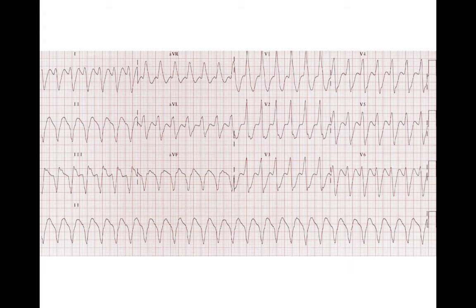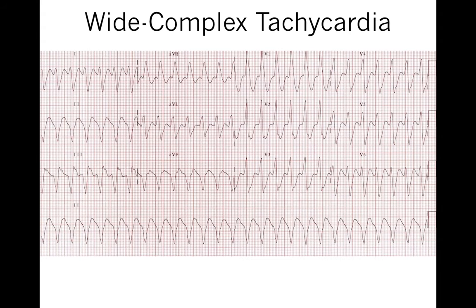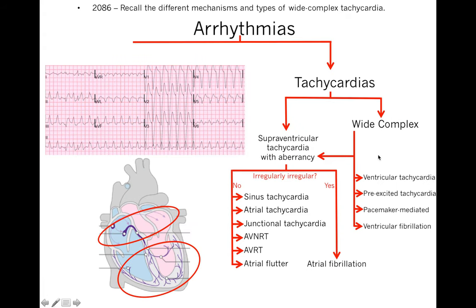Please interpret this ECG. This is an example of a wide complex tachycardia — the heart rate is tachycardic and the QRS is very wide. The differential of a wide complex tachycardia includes ventricular fibrillation, pacemaker-mediated tachycardia, pre-excited tachycardia, or ventricular tachycardia. In this case there are no pacemaker spikes, so it's not pacemaker-mediated. The rhythm is organized and monomorphic, so it's not ventricular fibrillation. So it's either pre-excited tachycardia, ventricular tachycardia, or SVT with aberrancy.